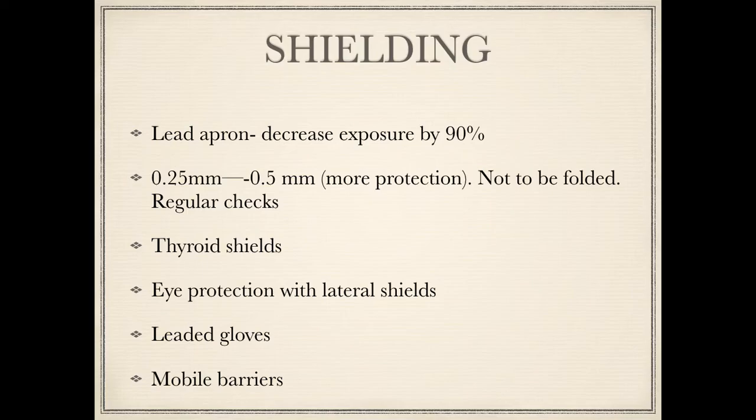Leaded gloves, I hardly ever use, because I try and keep my hands away from the image area, and I try and step back as much as I can when the image is being taken. Also, even if you are using these, the image quality changes because of the leaded glove being in your picture. So I don't use them very often.